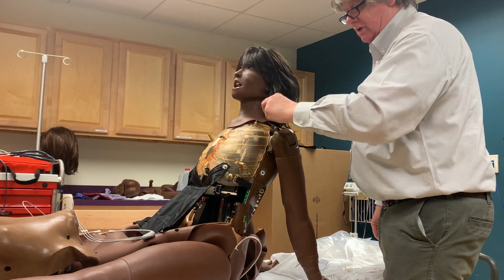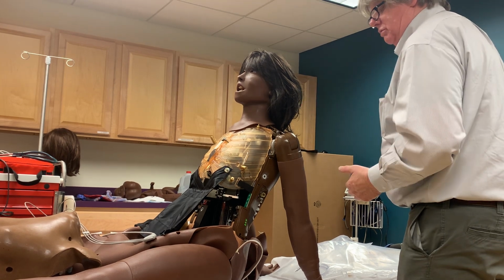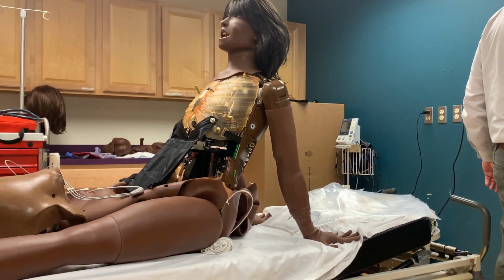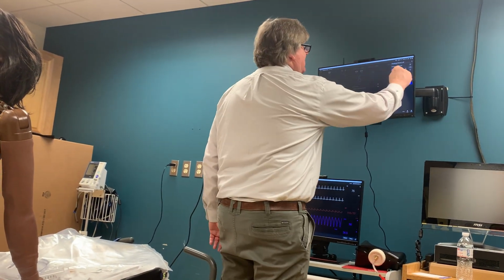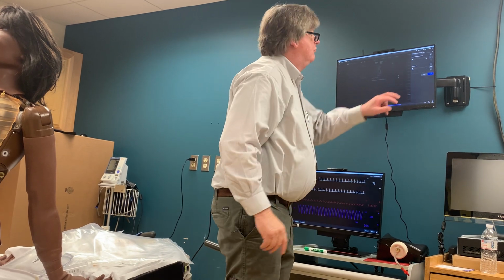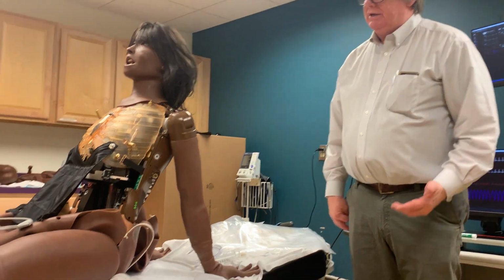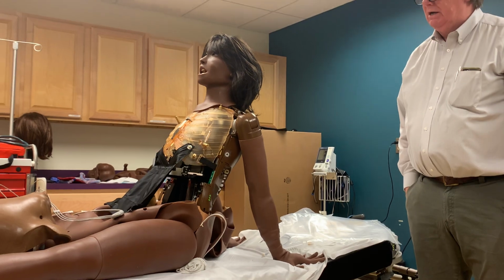Now, you cannot do a needle decompression in her, but let's say the students, or you were saying, what you would do is you would relieve that pressure by inserting a needle to relieve that, and then you could demonstrate that by coming in here. You could have a state that says needle inserted, and in that state, you could have this drop to 0 very quickly, say 5 seconds, okay? And now what you can imagine is now that air has been released, and now the one on the left side starts to function, okay?